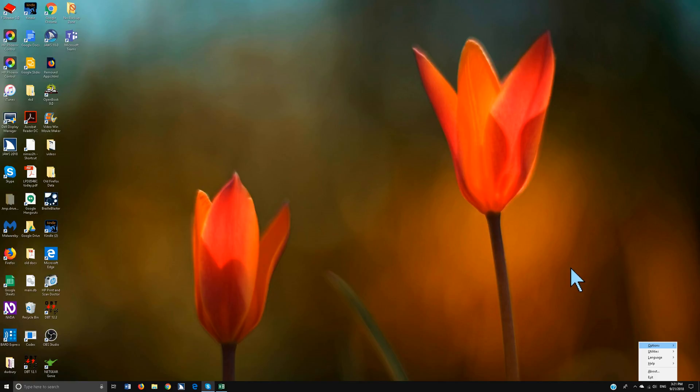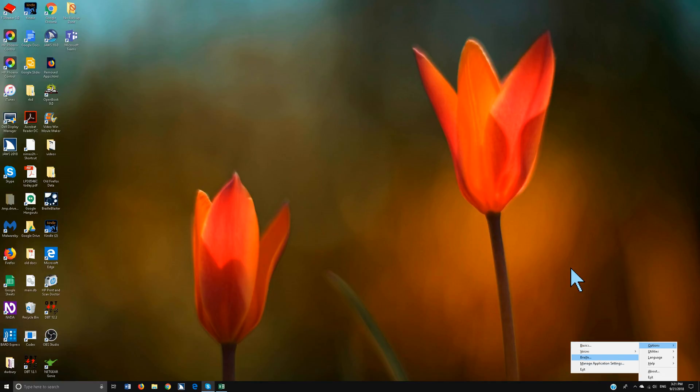Once you have done that you're actually going to hit your right arrow down to Braille and hit enter. I'm going to alt B to add a Braille display or if you're a mouse user right there. Alt B.